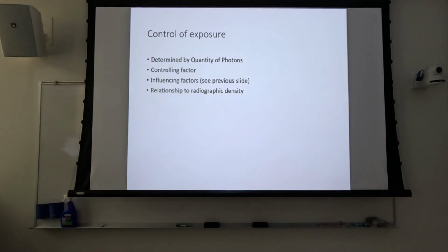So I think I've said this, probably beaten it to death, but I do really believe that at some point in your career, we're going to make a switch over, and kVp is going to be your controlling factor of all of that, because it lowers patient dose. It's easier on the X-ray tube. And since it doesn't really control contrast anymore, there's almost no reason to use mAs. But the industry hasn't really caught up with the technology yet. I expect it will eventually, and at that point you'll have to make a change.